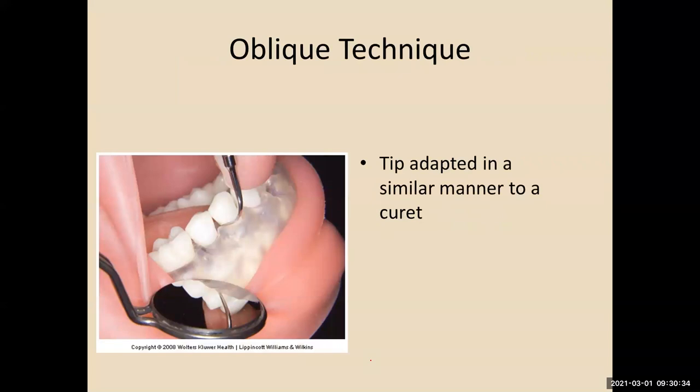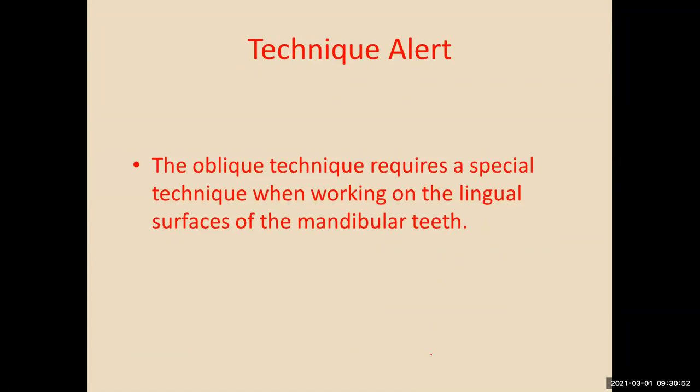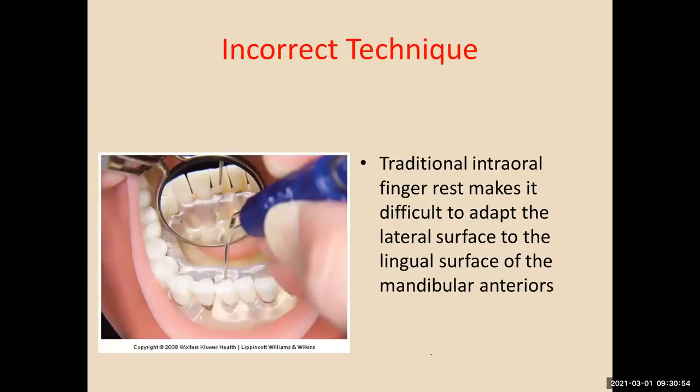It just looks like it fits, doesn't it? You want to keep a small angle of the tip third to the tooth, 15 degrees. And we will help you with this. Now, this is a particular typodont that has the clear gingiva, and you can see the deposit underneath the gum tissue here, which is really great.